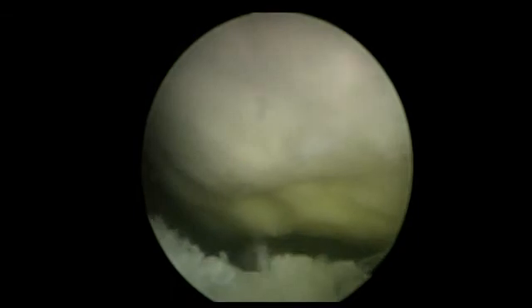This model offers realistic laser tissue interaction, anatomy — particularly of the surgical enucleation plane — and haptic feedback. Although there is no simulated bleeding in this model, HOLEP is generally a relatively bloodless procedure. So what you see with this model is not too dissimilar to the actual real life situation.